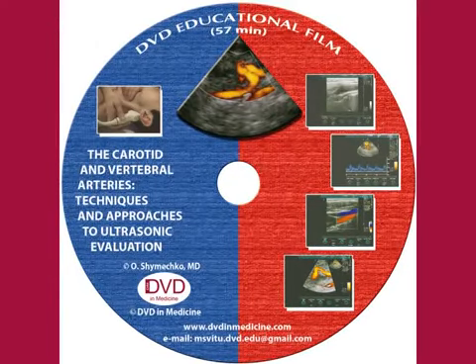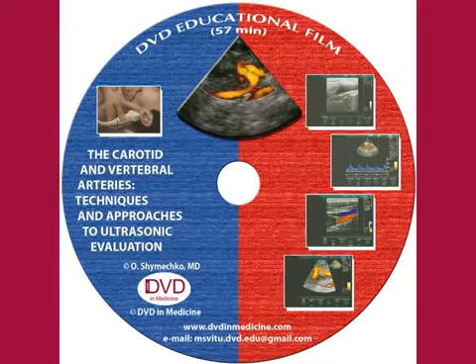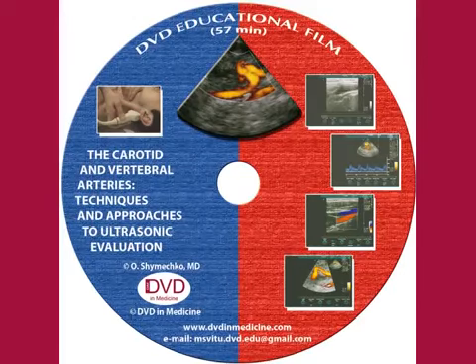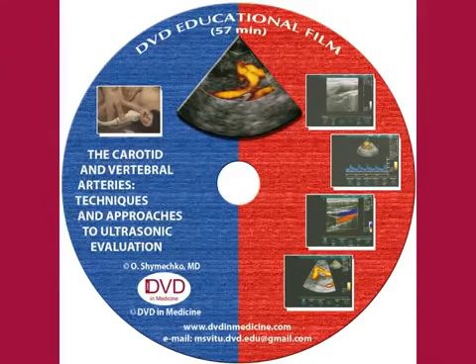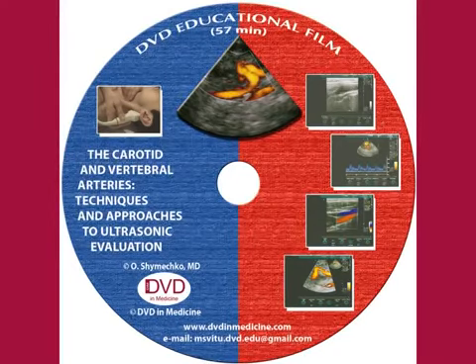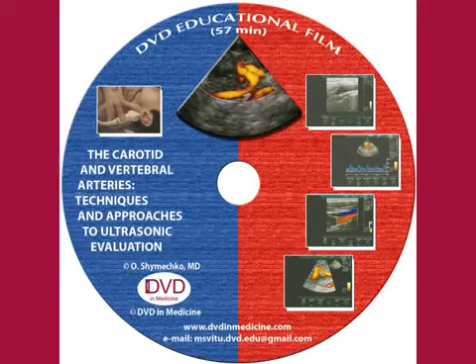In this film, we have demonstrated the approach to a routine investigation of the extracranial carotid and vertebral arteries. We have also demonstrated how to obtain all necessary dimensions for these arteries. Once one reveals the pathological course of the vessels, the anomalies in the arterial wall, and the increased diameter of the artery or pathological Doppler spectrum, the patient deserves a more detailed analysis, which will be the topic of our next films.